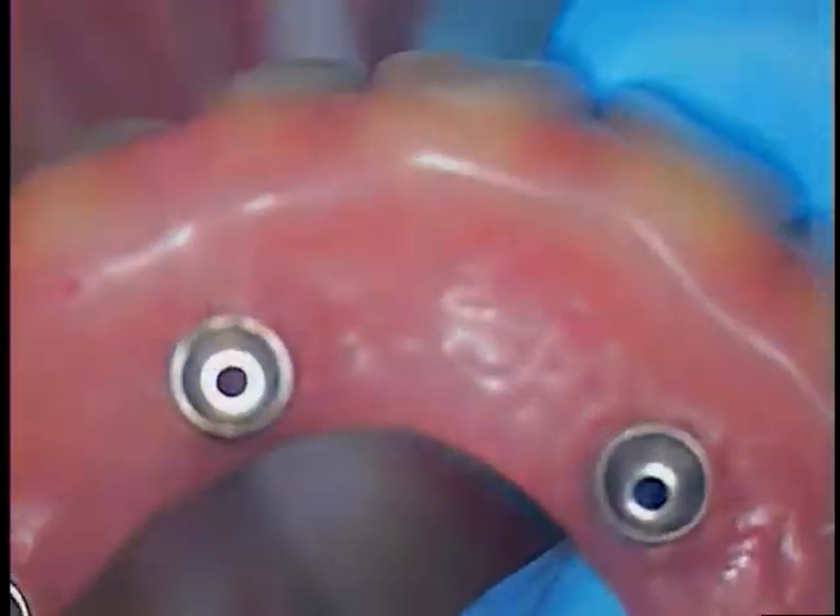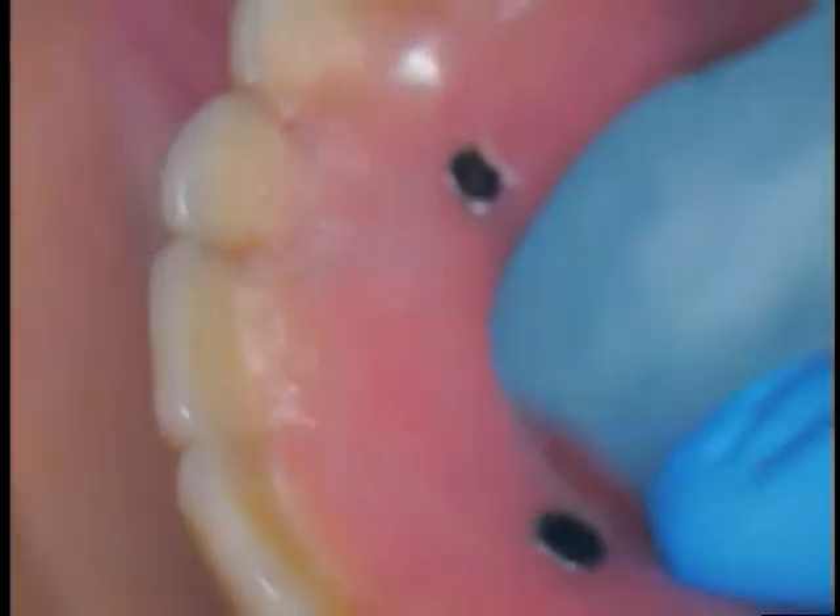Hello, this is Dr. Jerry Cuomo. I'm back with my all-on-four case that we're repairing the denture base. This is the denture base now fully repaired with metal reinforcing that area of the fracture.